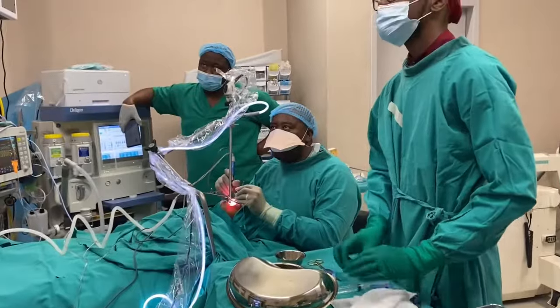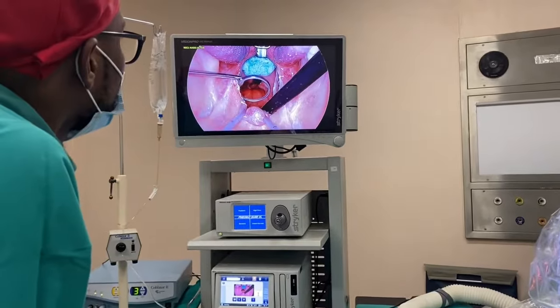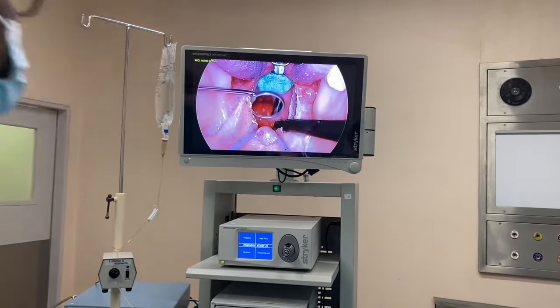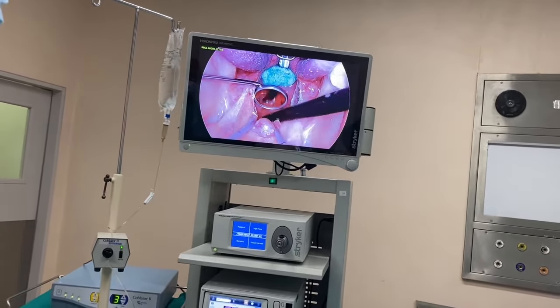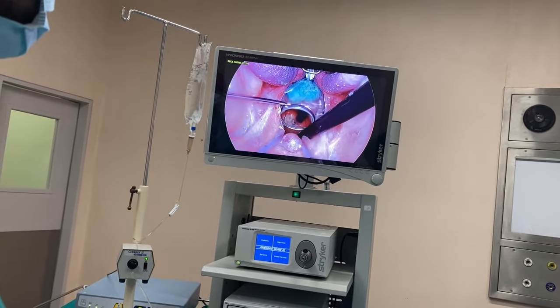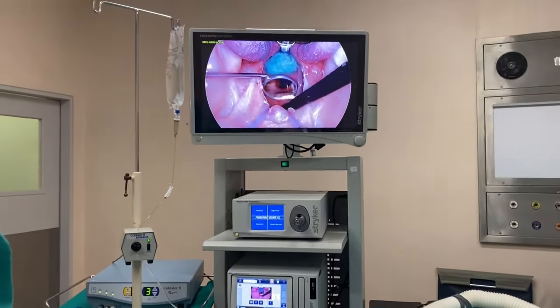And that is the laryngeal mirror. You can see that laryngeal mirror gives us a view of the adenoids in the nasopharynx. What you see there where I'm pointing is the septum — the same septum that you see in front in the nose. So now we are looking from the back, and that mound is the adenoids. I increase my power setting to nine to give it more power. Because here we are going to debride. And even the debridement, you must not be greedy — just bits and pieces, bits and pieces. Before you know it, the whole of the adenoid tissue is yours.